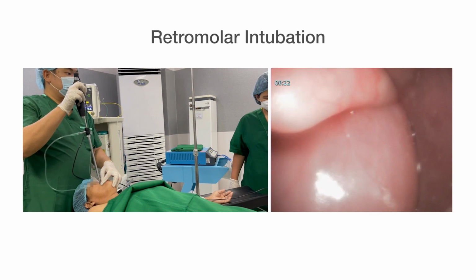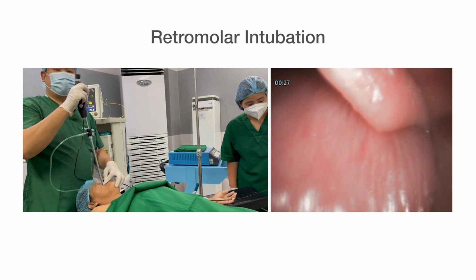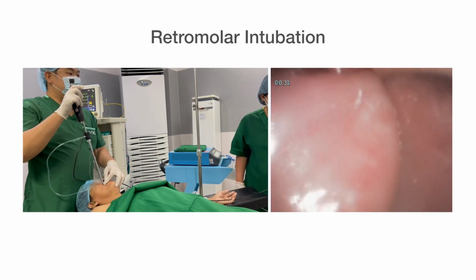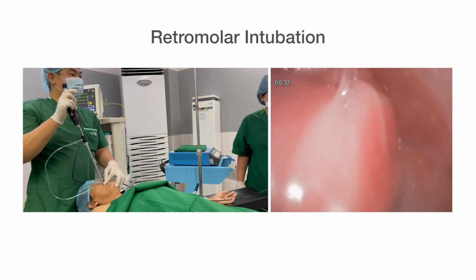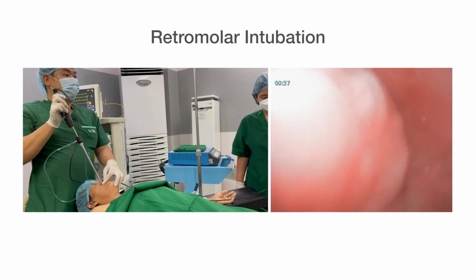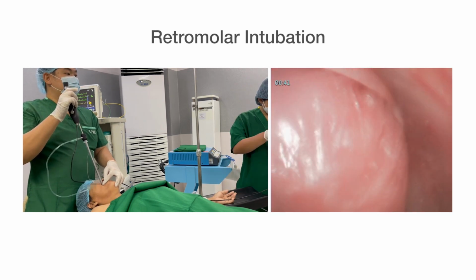At this point, we are looking at the epiglottis. Now we have to maneuver the scope under the epiglottis. A lot of times you will end up at the piriform fossa.